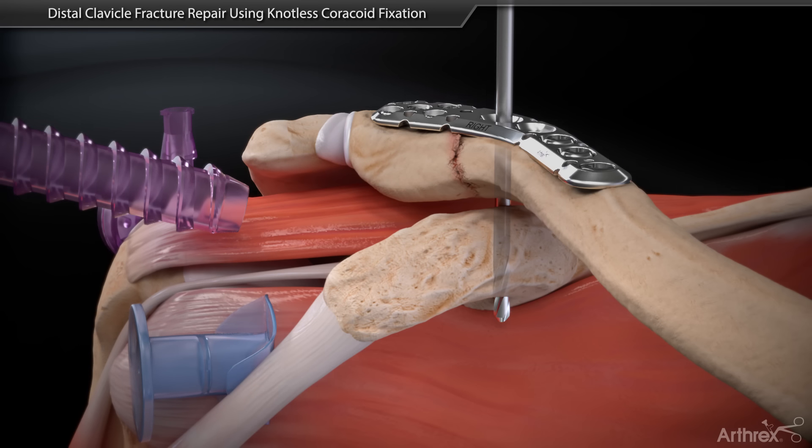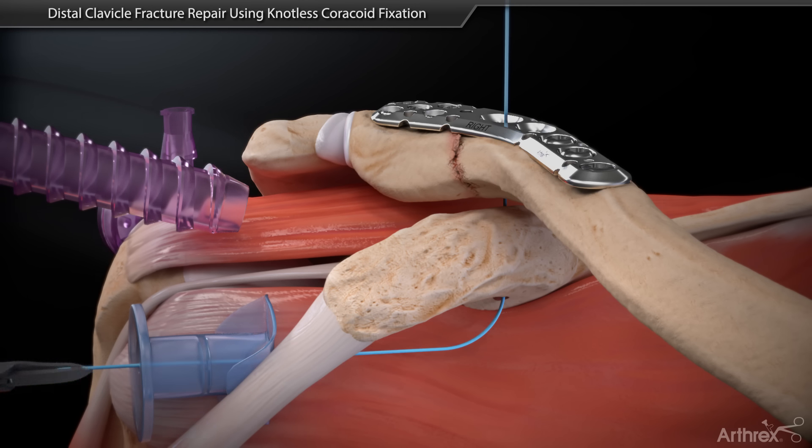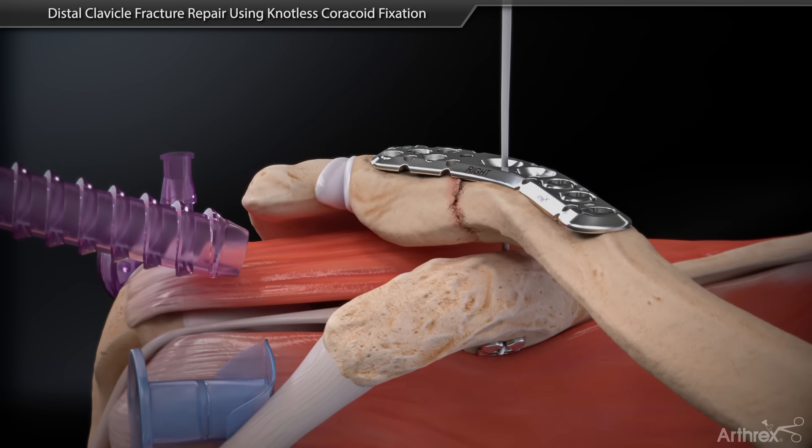Remove the guide and retrieve a fiber stick through the drill. Shuttle the knotless tightrope loops through the bone tunnels and attach a dog bone button to the loops. Shuttle the loops until the dog bone button seats at the base of the coracoid.